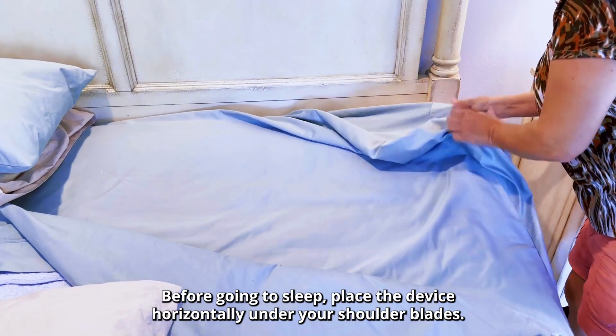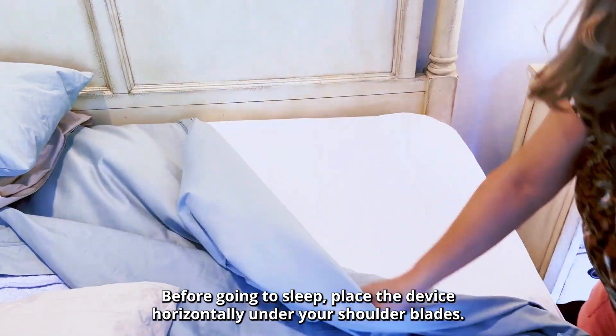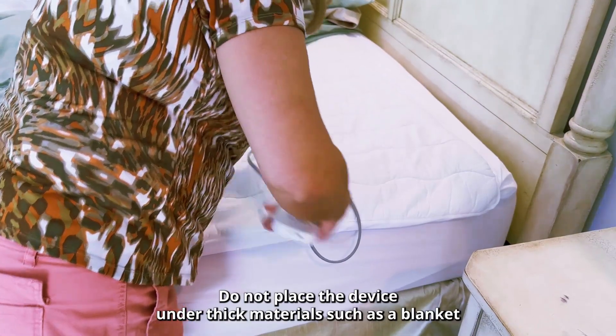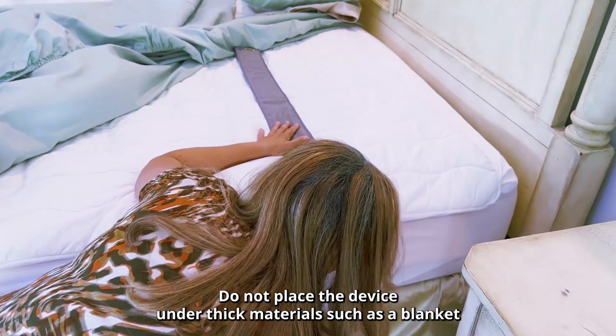Before going to sleep, place the device horizontally under your shoulder blades. This can be underneath a sheet or mattress cover. Do not place the device under thick materials such as a blanket.